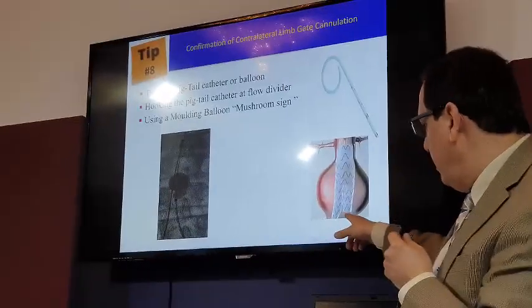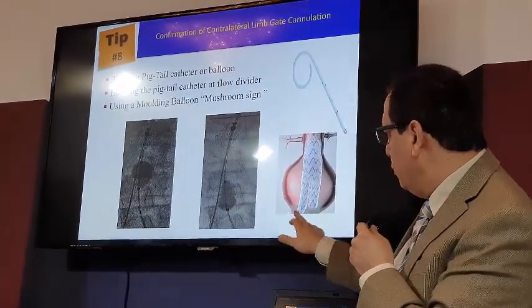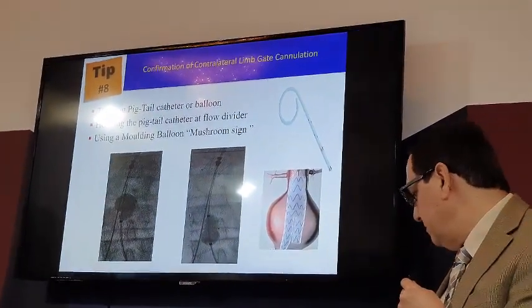Or you can put the balloon here, and you get the mushroom sign here. This will be narrow here, and there will be wide here, like this one. So this is also one way to be sure you are inside the graft and not behind it.